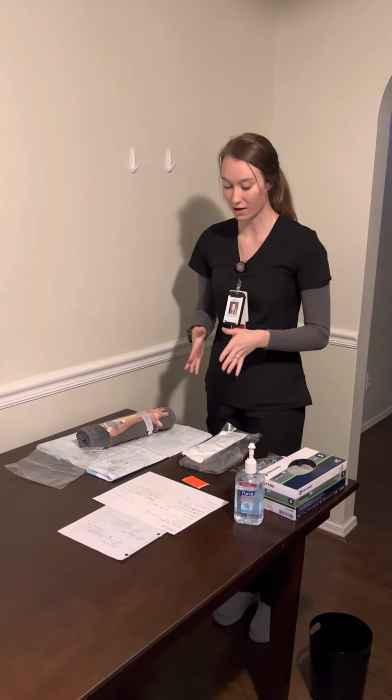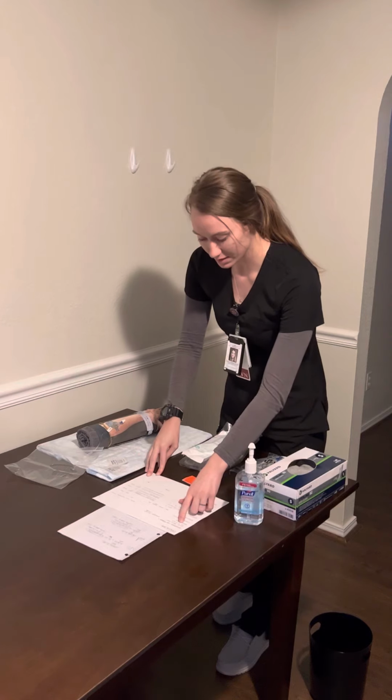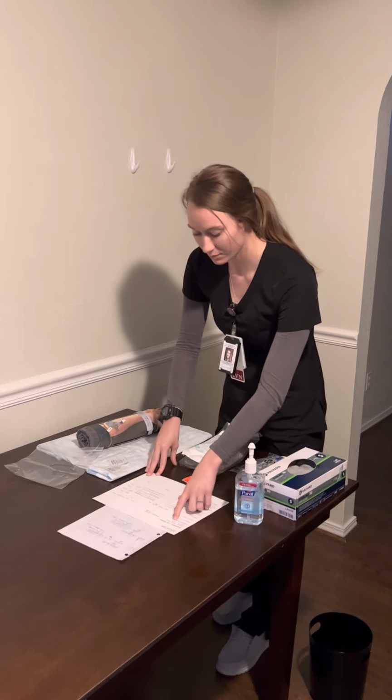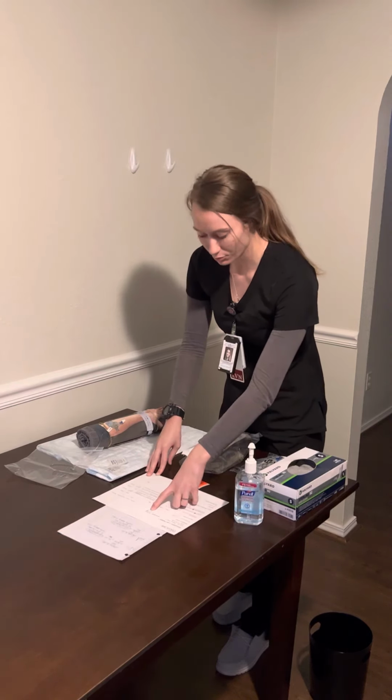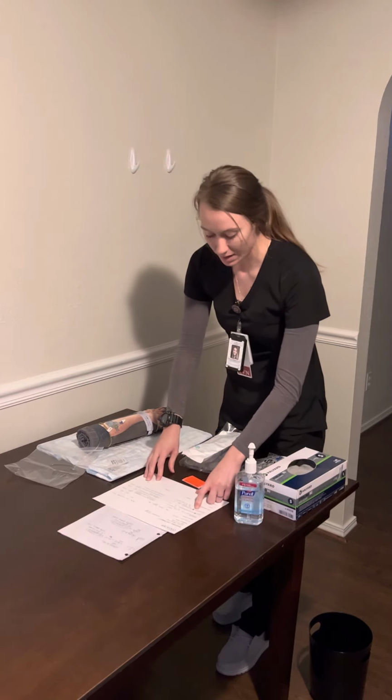So first, I have my patient's MAR printed out. It is for Davis Ellen. Date of birth is 9/19/1965. She has an allergy to pollen, but no known drug allergies, and she's due for two fluids now.